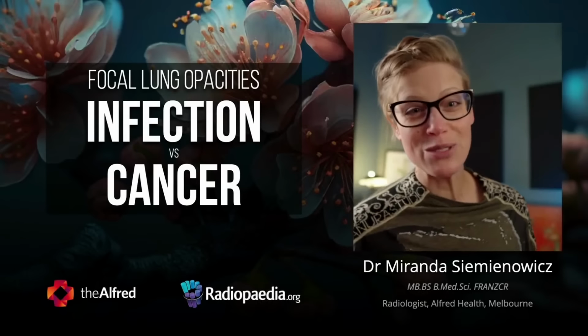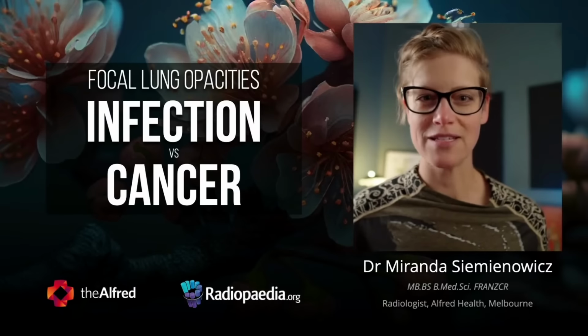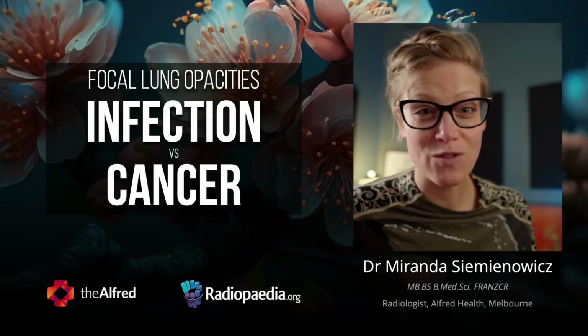Hello and welcome to this talk where we will review the morphological features of focal lung opacities that are predictive of benign and malignant etiologies. My name is Miranda Siemienowicz. Thank you very much for joining me.